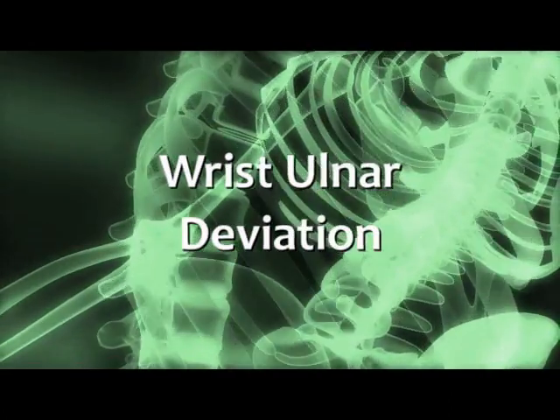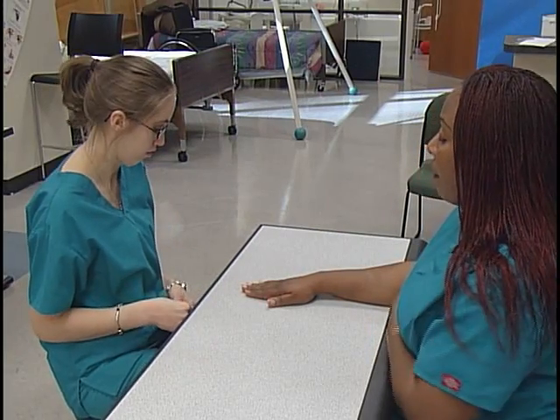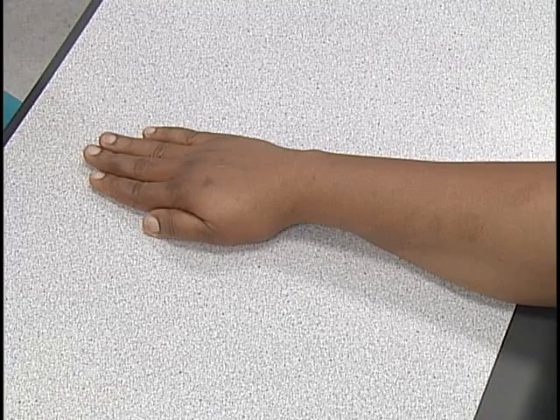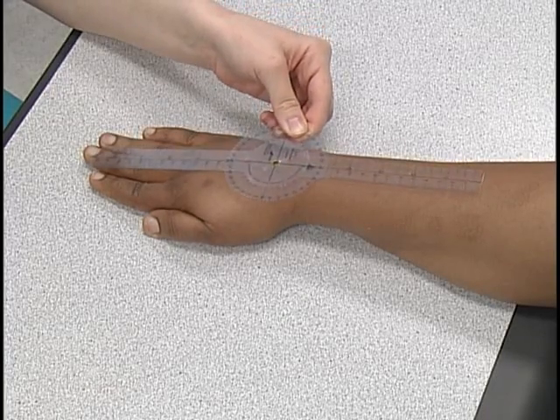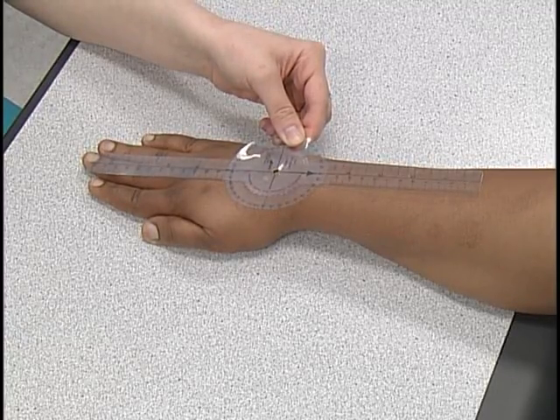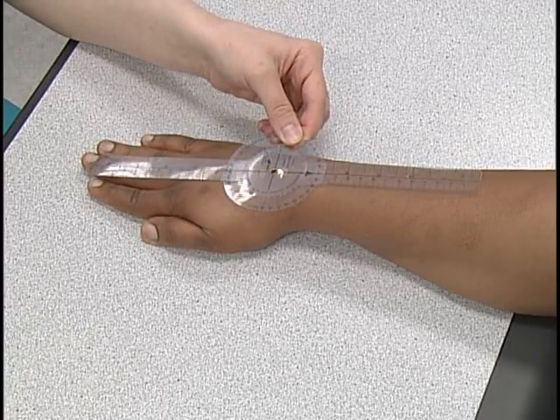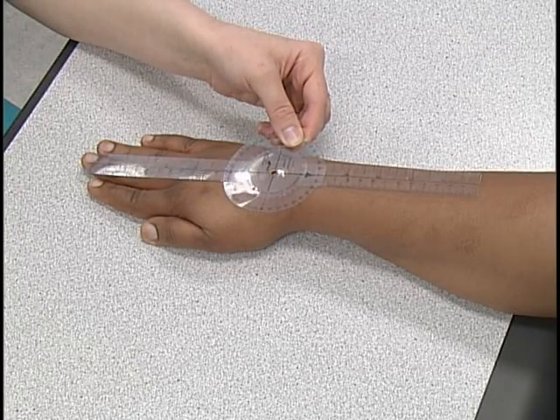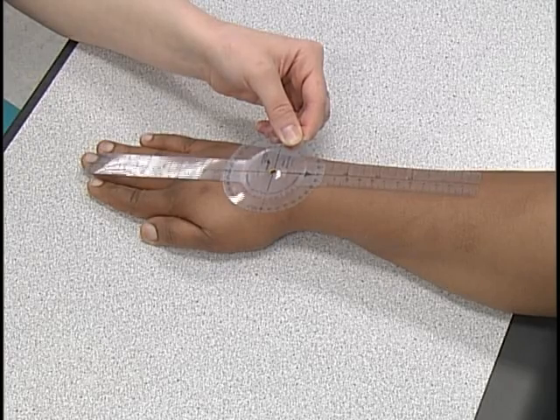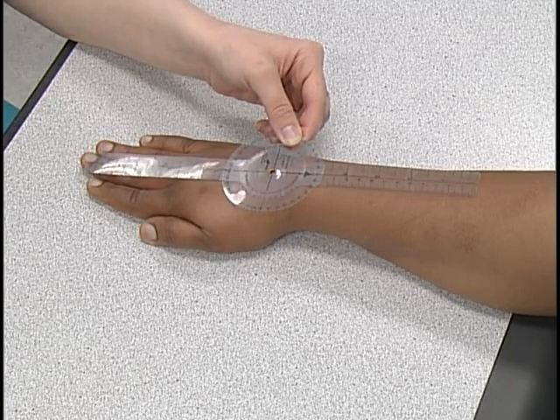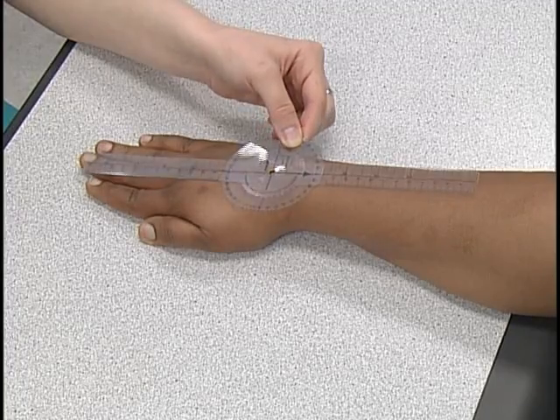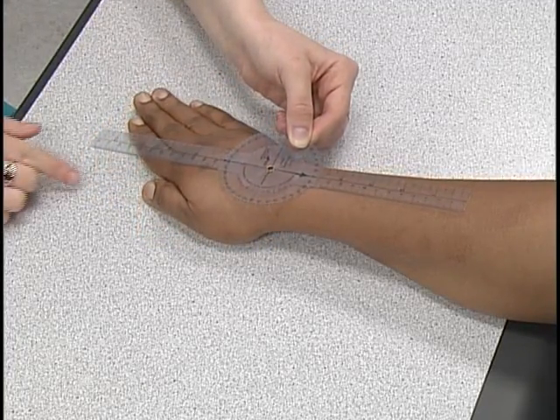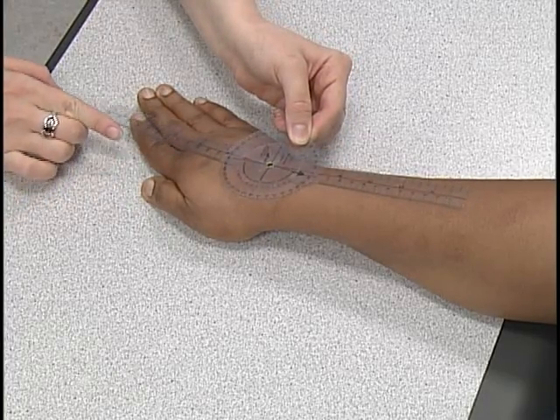For wrist ulnar deviation, the client is seated with the forearm pronated and palm of hand resting flat on the table surface. The goniometer is positioned so that the third finger lines up with the center of the forearm. The axis of the goniometer is on the dorsum of the wrist at the base of the third metacarpal. The stationary bar is positioned in the center of the forearm and the movable bar is parallel to the third metacarpal. The client's hand is laterally extended in a horizontal plane of movement. The measurement begins at zero degrees and ranges to 30 degrees.